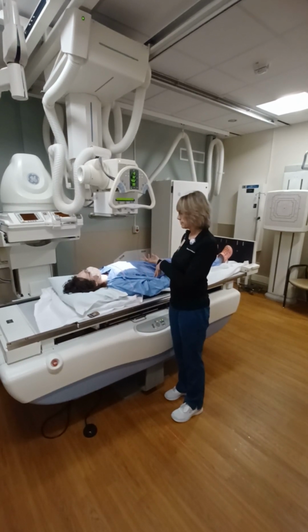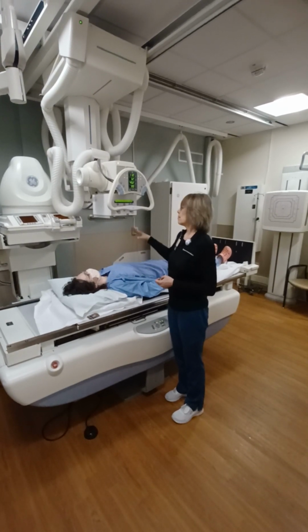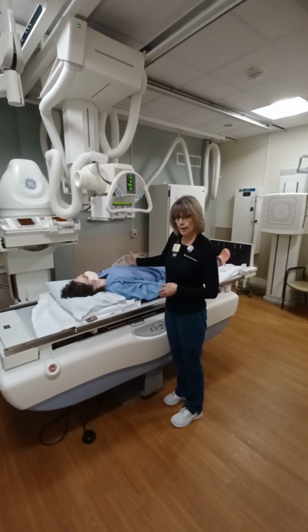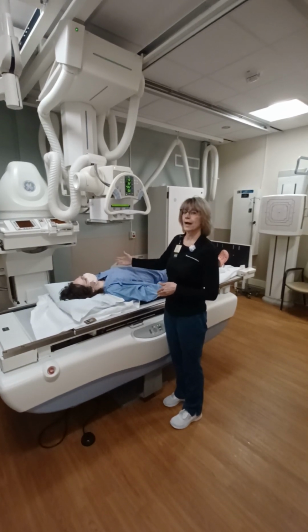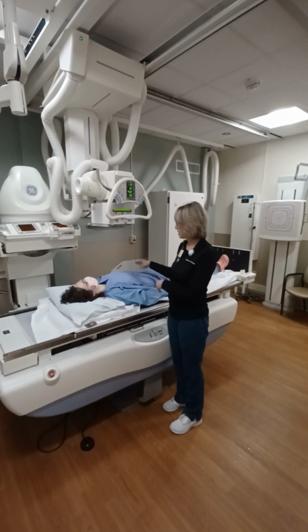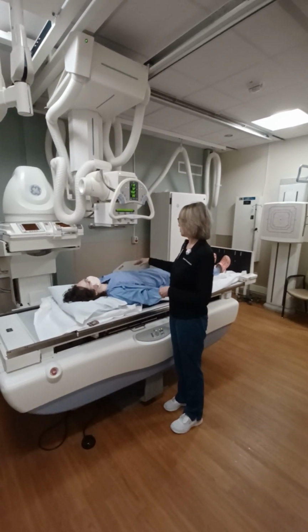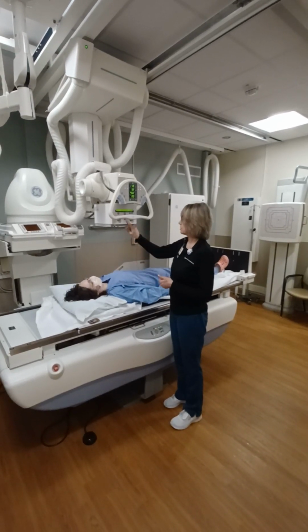So when your patient comes in the room, you want to look at their average habitus, the sthenic. Possibly they could be more hypersthenic. If you have a hypersthenic patient, the stomach will lie higher up in the abdomen and be more transverse. So you're going to have to center higher. If you have an asthenic patient, which is a very thin patient, the stomach is now going to come down, possibly way into the pelvic area. So then you're going to center lower than you would for your regular average patient.